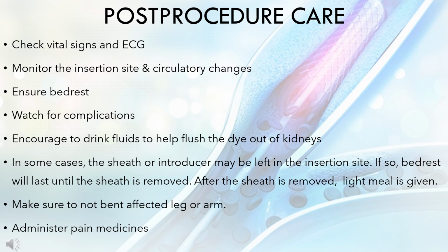In some cases, sheath or introducer may be left at the insertion site. If so, bed rest will last until the sheath is removed. After the sheath is removed, light meal is given. Make sure to not bend the affected arm or leg and administer pain medications.